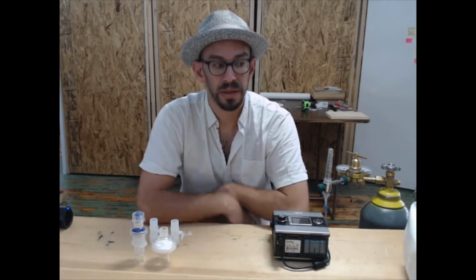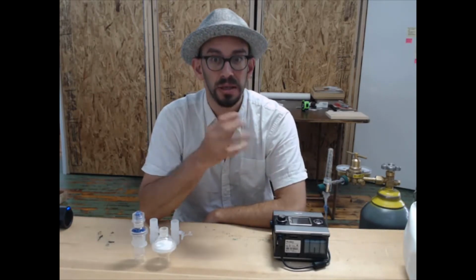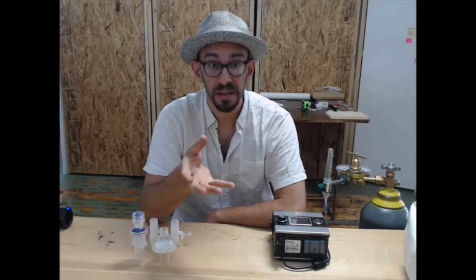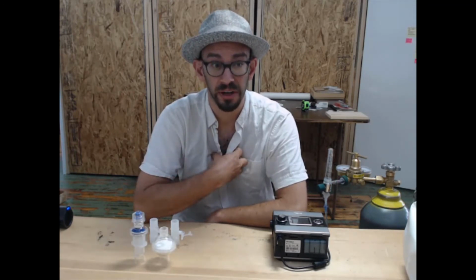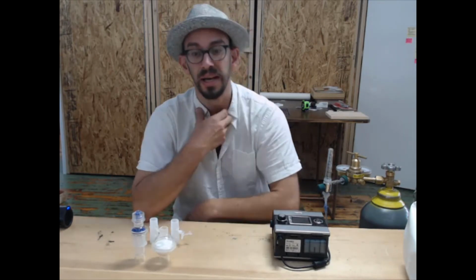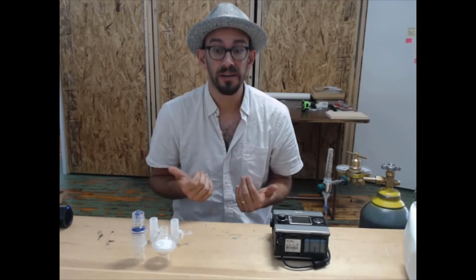Now, what you'll see is there are some patients that this circuit does not work for. The circuit is really designed to work for patients who are able to breathe on their own, who have adequate tidal volume, but have poor blood oxygen. If a patient is really unable to breathe, if their tidal volume is low enough that they're not flushing CO2 from their system, this is not the right circuit.